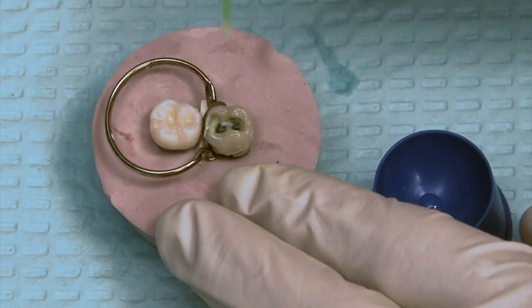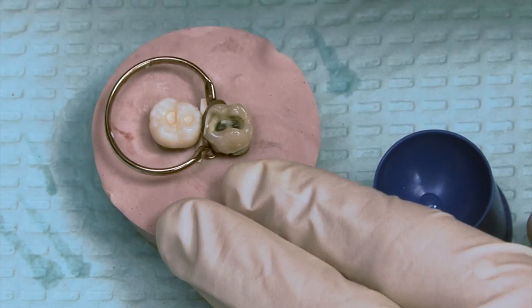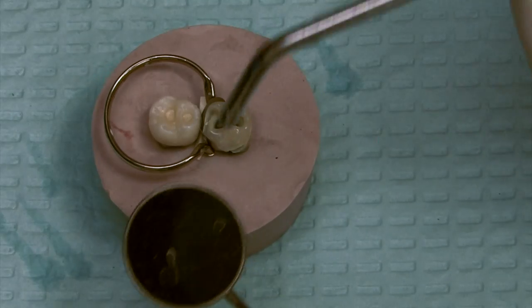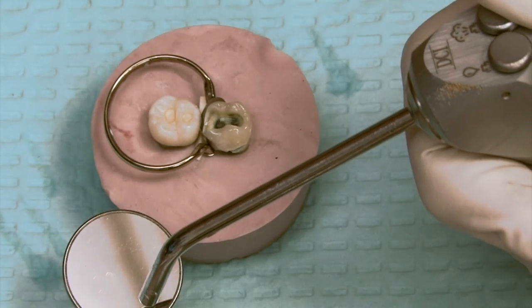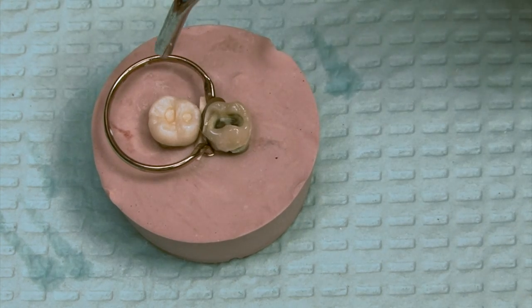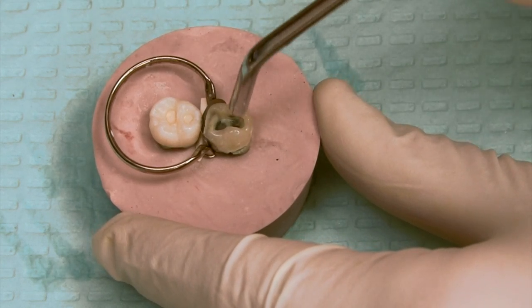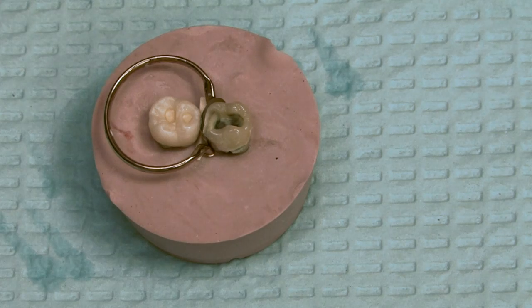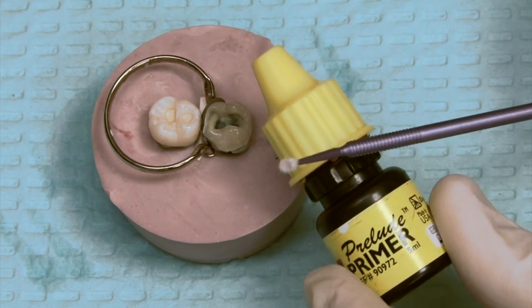The idea is to apply the solution, scrub it around on the teeth, and then blot dry, going back and forth from the patient's bib to the tooth, just trying to remove the excess. Of course, we make sure we've got good isolation — absolutely no saliva is coming in. We use dry angles and cotton rolls. Whenever I'm going to dry a prep, I always test it on a mirror first, depressing the air button to make sure there's no spritz of water that will contaminate the prep. We'll get it to the point where it's just gotten dry — not overdry, but no puddle of material either. It's like if you licked your finger and blew on it — that's the level of wetness you want.